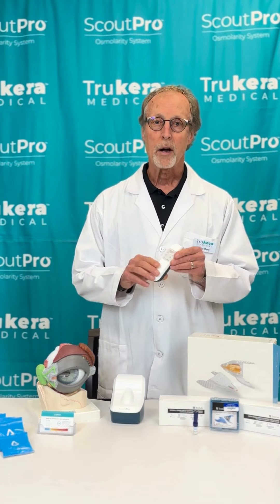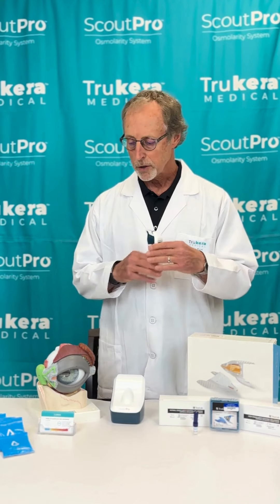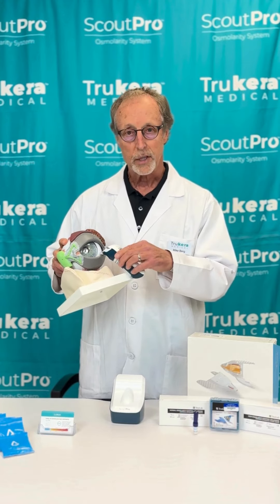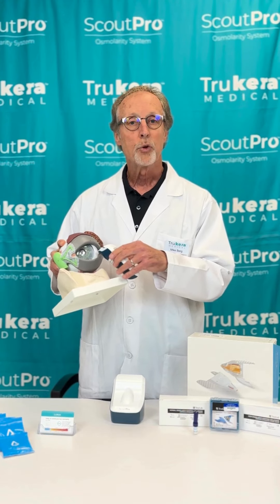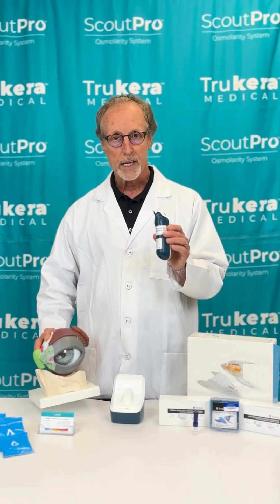The first tip I want to talk to you about is the ER message. If you get an ER message when you're doing tear collection, it's easily resolved. The ER message occurs when after you get a test collection and the pen beeps, if you do not remove the pen immediately from the eyelid, you will always get an ER message.